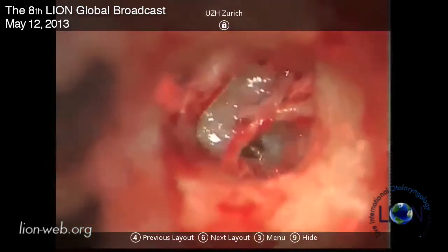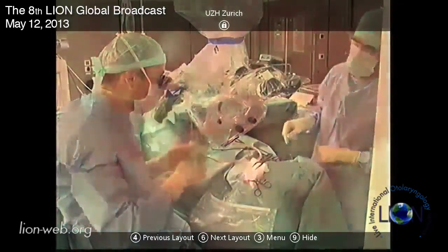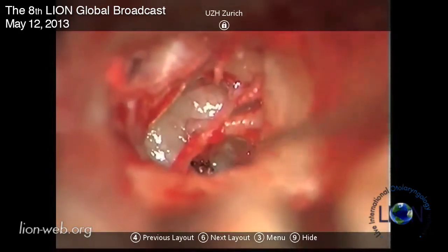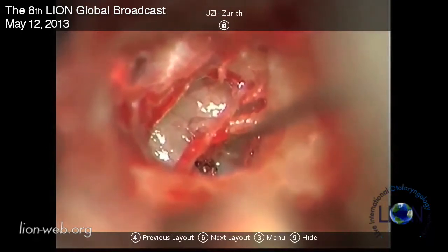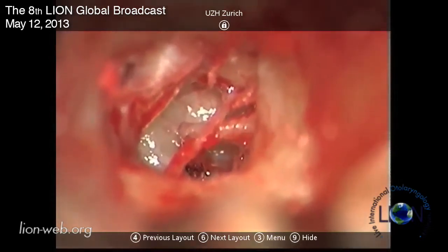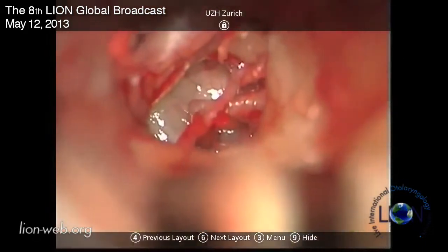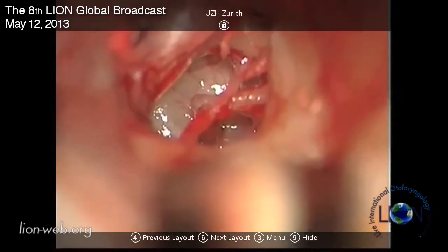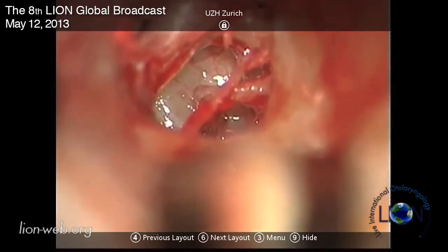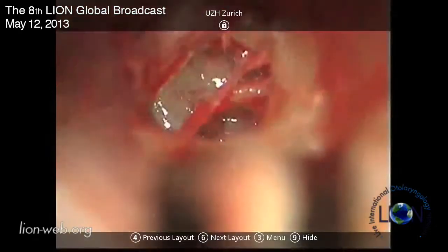Now I try to see if I can see the anterior crus as well. There is mucosa over it which I take off first, and then we'll see if we can - yeah it's going to be difficult. It's not so easy to see, but you can just see it on the edge. I will give a few shots on the anterior crus just to make sure it's thinned out a little bit.